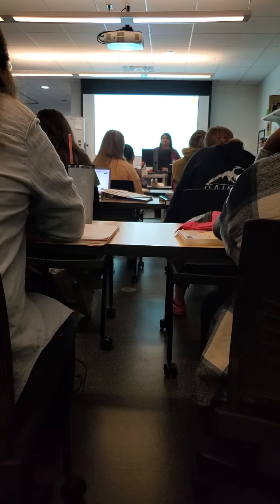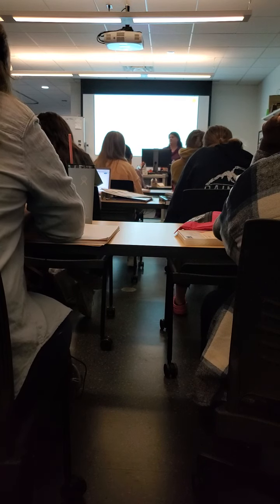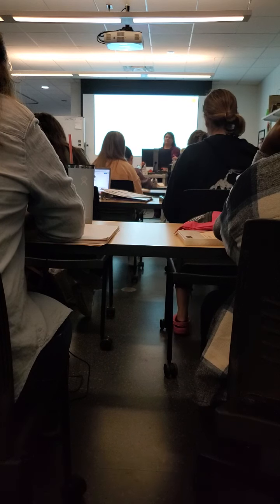Okay, the measurement at the main portal vein can vary, but should always measure less than 13 millimeters. Otherwise, and that's an AP diameter. Does anybody remember what AP diameter means? Anterior, posterior. Yeah. So most likely this is going to be a sagittal measurement. You can also do it in transverse as well.